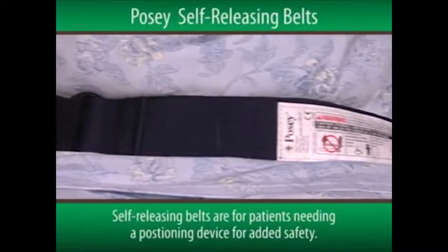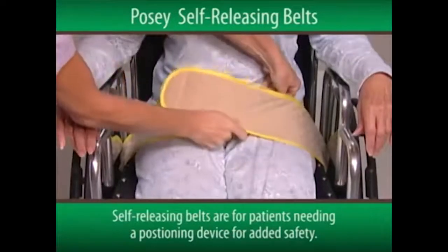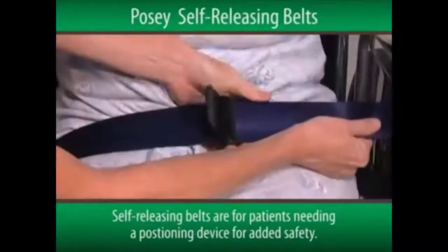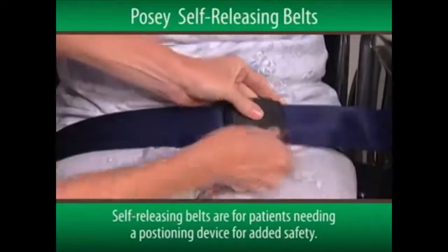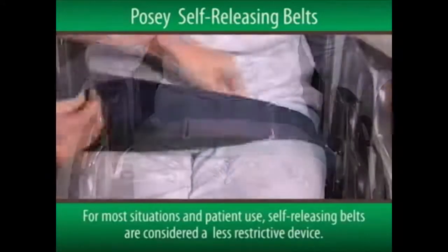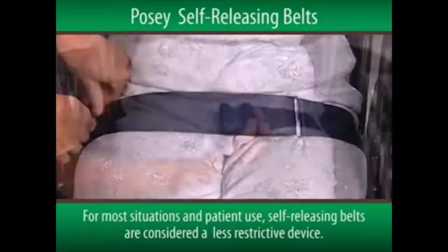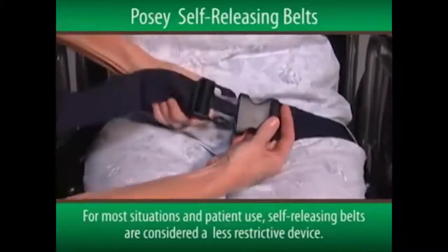The POSI self-releasing belts are for patients needing a positioning device for added safety, or those needing a reminder to call for assistance before exiting a wheelchair. For most situations and patient use, self-releasing belts are considered a less restrictive device and should be tried before other more restrictive methods are employed.